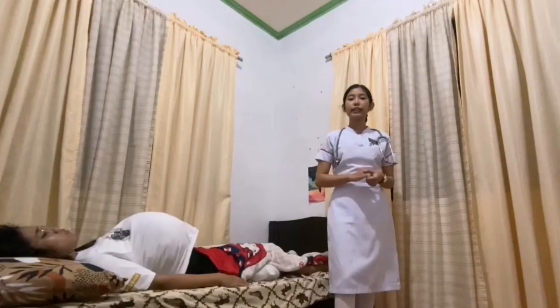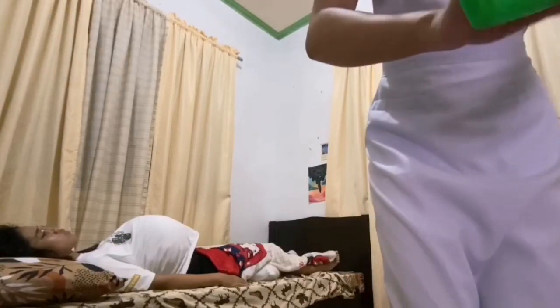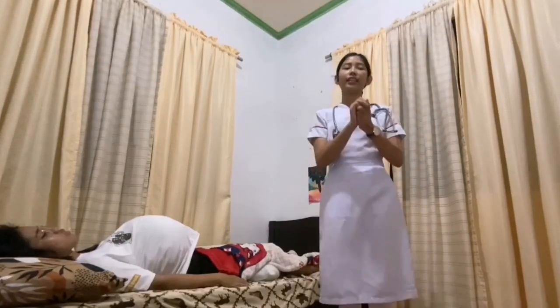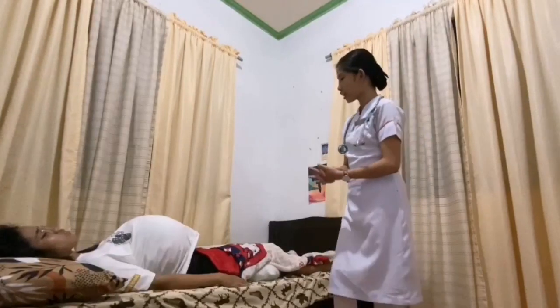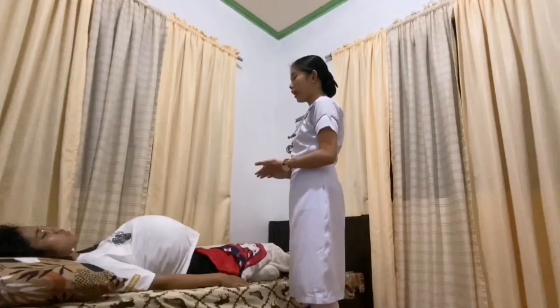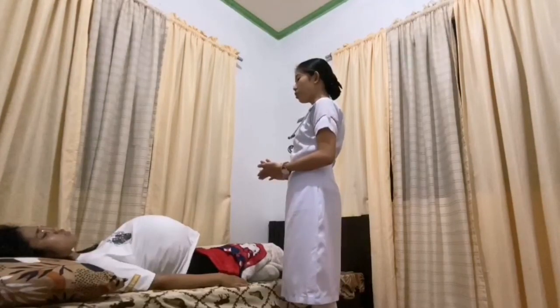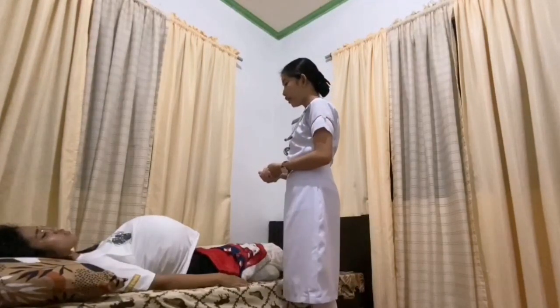For the taking of fetal heart tone using the stethoscope, the first thing is to wash hands to avoid the spread of microorganisms. After that is to explain the procedure to the patient, as listening to the baby's heart rate is a routine assessment to check the baby's condition. Good day, ma'am. I am your student nurse for today, and the procedure we are going to do is to take the fetal heart tone using a stethoscope. Ma'am, would it be alright to auscultate your abdomen?